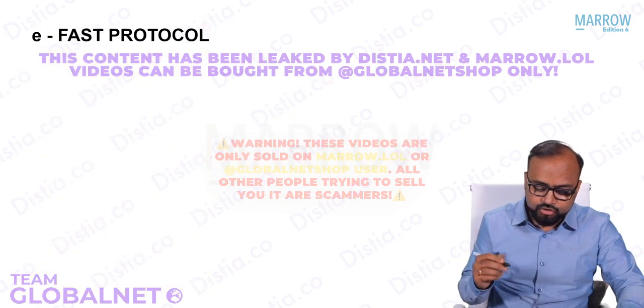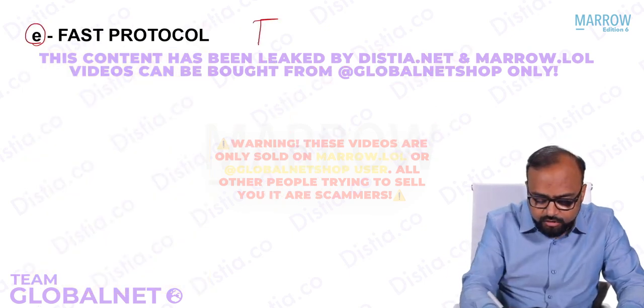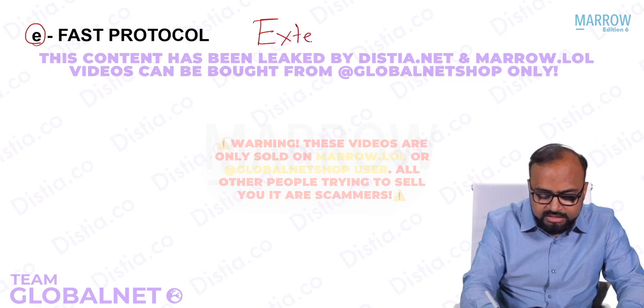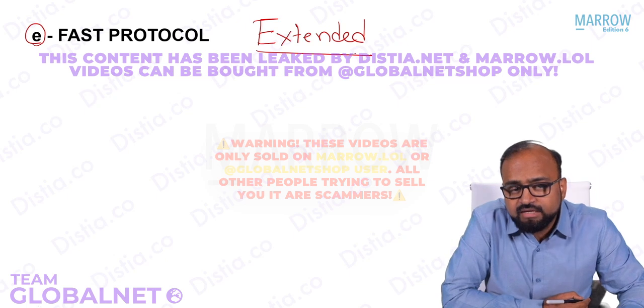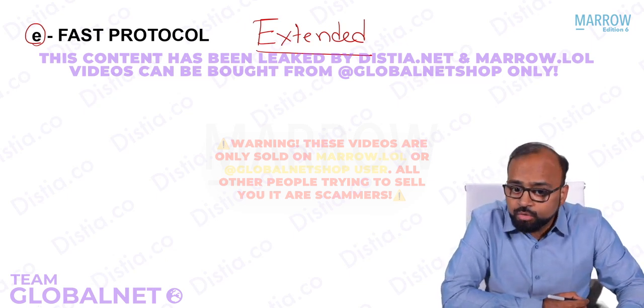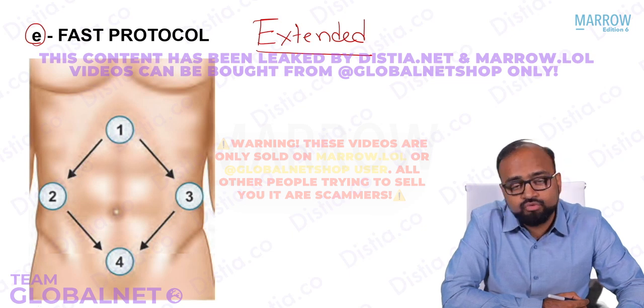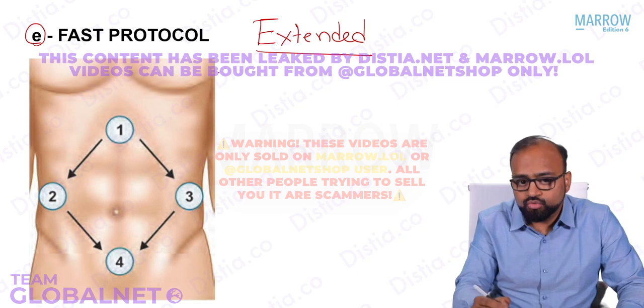Yes, now there's something which is called E-FAST. What does E in E-FAST stand for? E stands for extended FAST. So what is this extended FAST? When you extend the evaluation of FAST by involving the thorax. So thoracic views are obtained, right? The thorax is assessed usually at 2 sites.